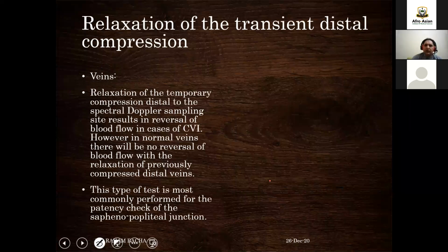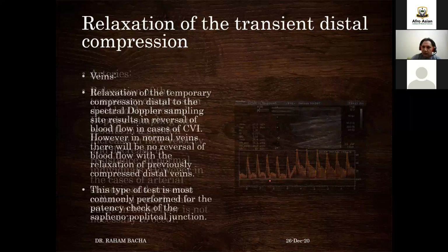Relaxation of transient distal compression on a vein. Whenever there is some distal compression distal to the sampling site, what will happen with the vein?